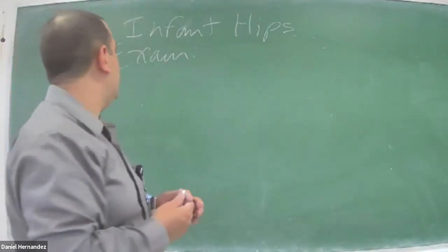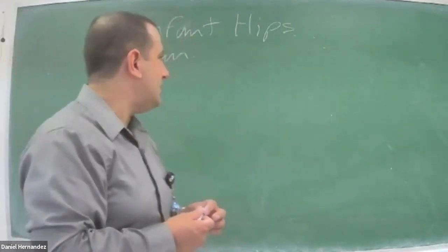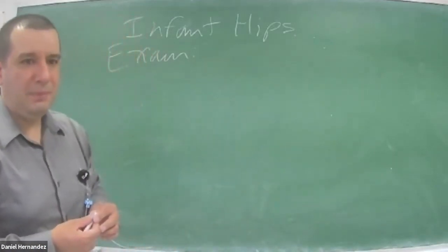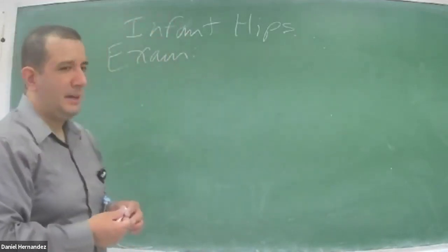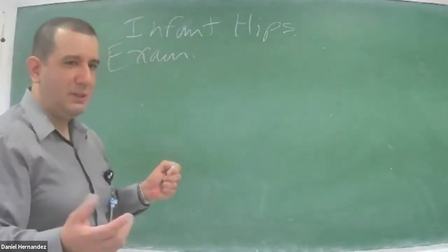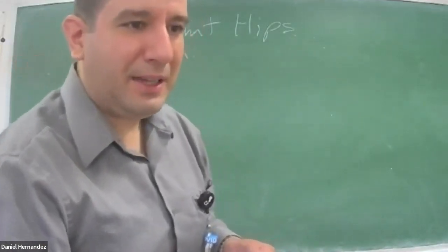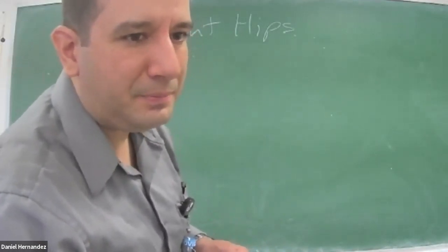So, you want to make sure that, first off, the baby is relaxed and comfortable. It's going to make your test a lot easier. These babies don't have to be NPO, so they're able to feed, so encourage feeding before the exam. Make sure your room is nice and warm. You have your blankets, nice warm gel. You could potentially have toys, or mother can bring toys to distract the baby. Parental assistance is often useful too, so you don't have to kick the parents out of the room. They can lie on the stretcher next to the baby, try and keep them calm.